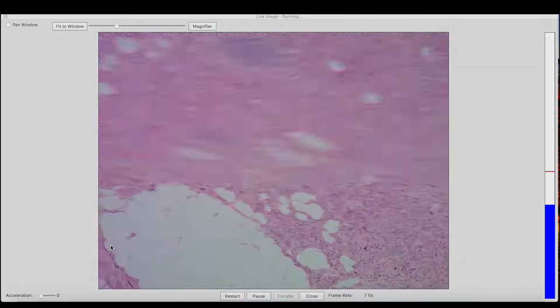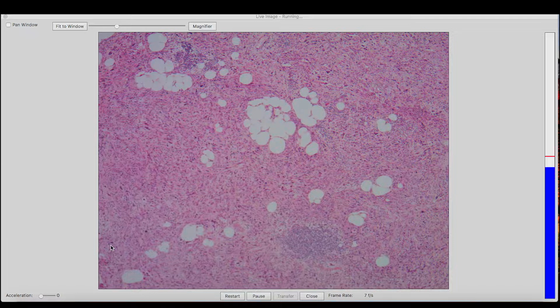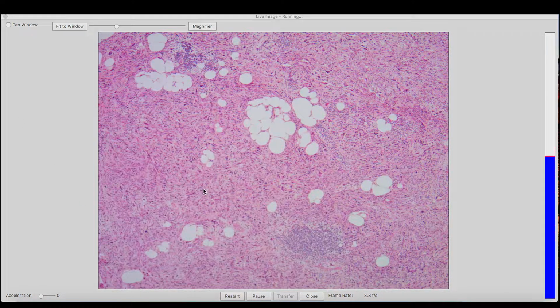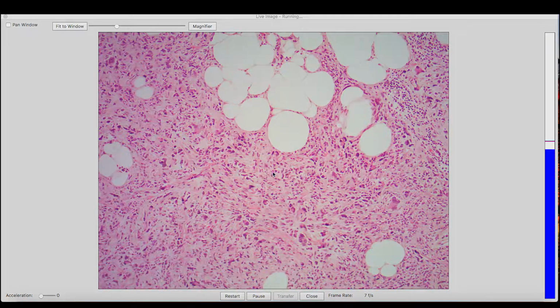Very often, lesions such as this are removed by general surgeons because they're superficial, and often these get shelled out. At higher magnification, you can see an admixture of fat and a pretty cellular proliferation of cells, which even at low power shows some cytologic atypia, which is a little bit concerning. Spending a little more time at higher magnification, this is pretty cellular.